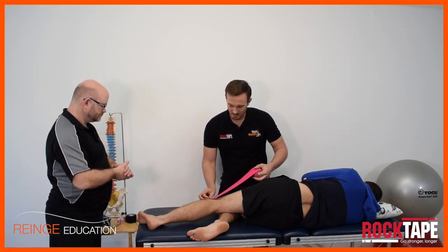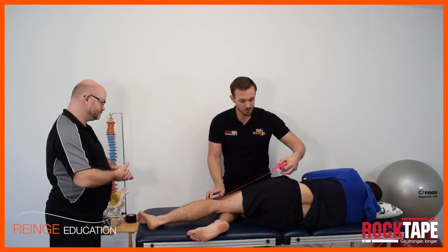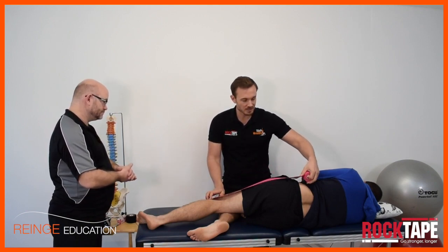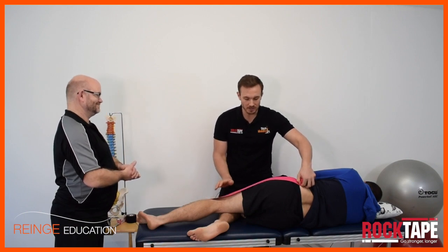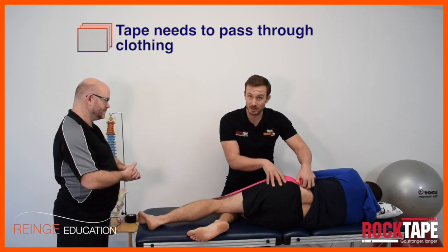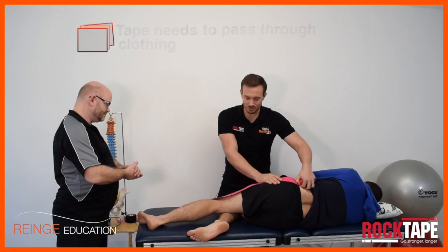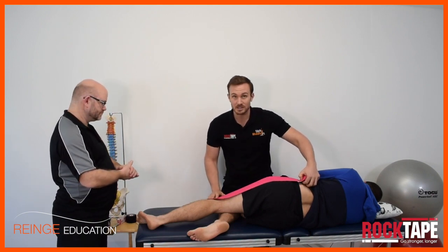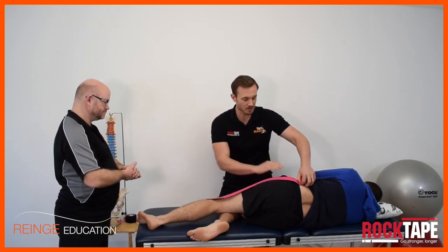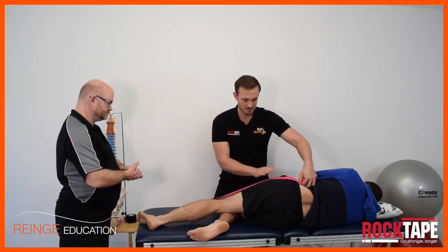The key thing with this one is that applying the tape is fairly easy, especially if you've applied a few tapes before. But the key thing here is to get the tape to pass through clothing — through shorts and underwear — without the patient having to undress, and without you having to shove your hands awkwardly under their shorts. I'm going to show how to pass tape through clothing in a nice, easy-to-apply clinical way.